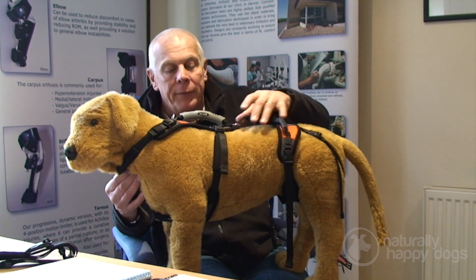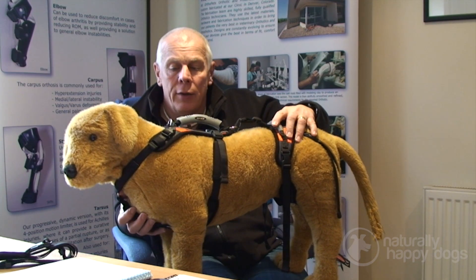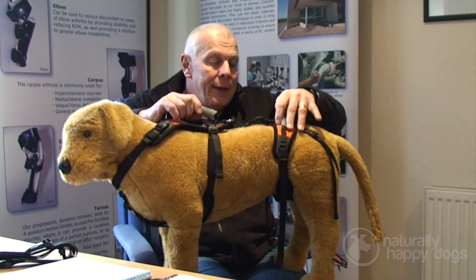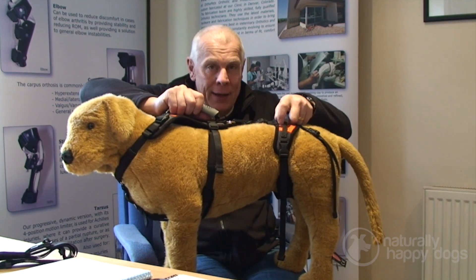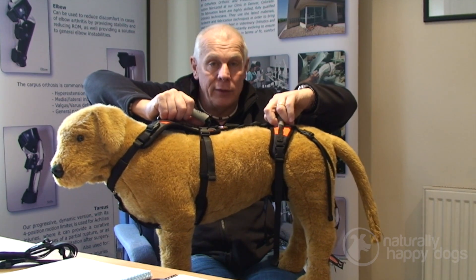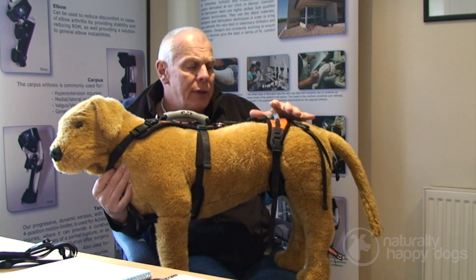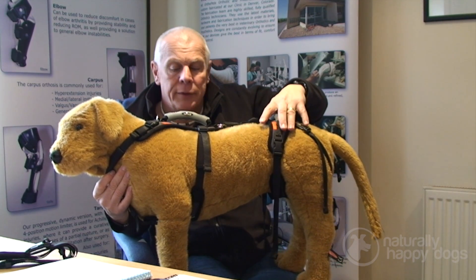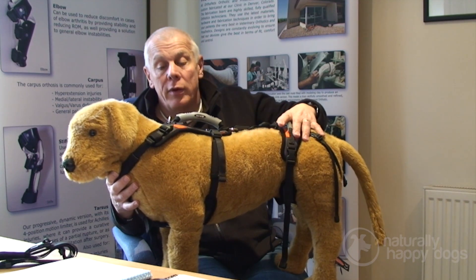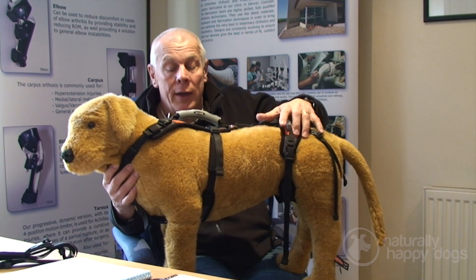The Help Them Up was originally designed for helping nurses in hospitals move spinal patients around, where they needed to keep them straight and balanced but provide a little bit of help, take a bit of weight off them, and provide them with stability. It was found that the hospitals were selling them to clients for general mobility and lifting, to the point where now the harness is distributed far and wide.